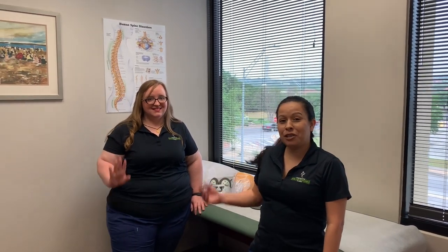Hi, I'm Priscilla. I'm Dr. Lu's medical assistant. This is Sarah. She's going to show us how to properly wear your cervical collar after surgery.